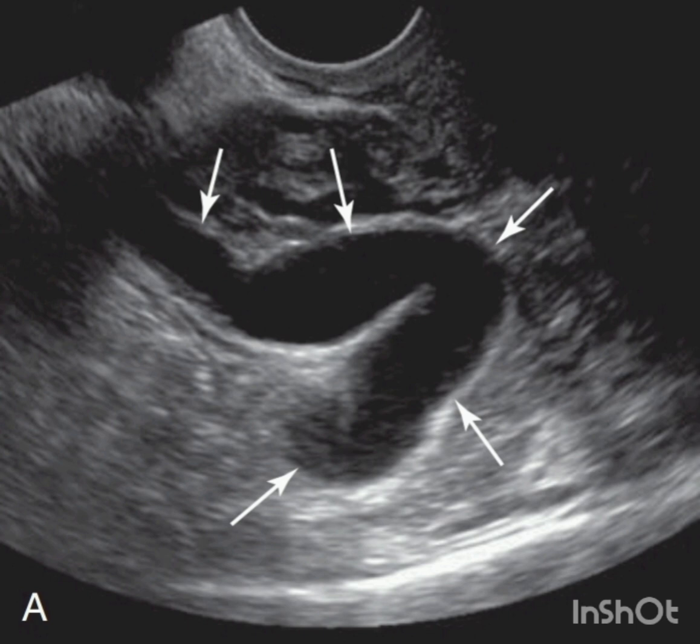Now, normally you cannot see fallopian tubes on ultrasound. You can see them when there is some ascites in the pelvis, and the fluid then becomes the window which makes the fallopian tubes visible, connecting the ovaries to the uterus. But when the fallopian tubes are blocked and filled with fluid and dilated, you can easily see them on ultrasound.